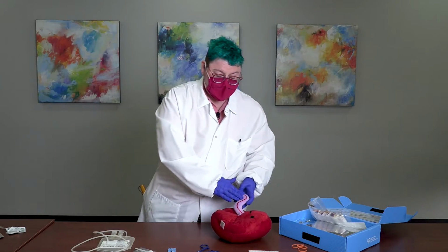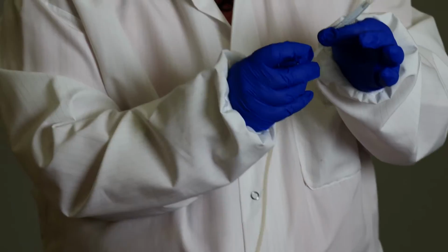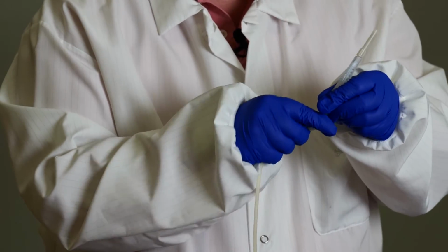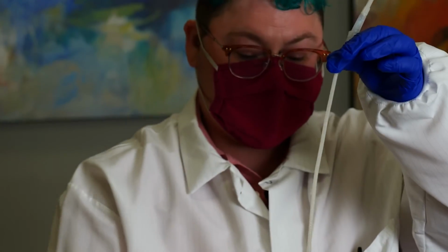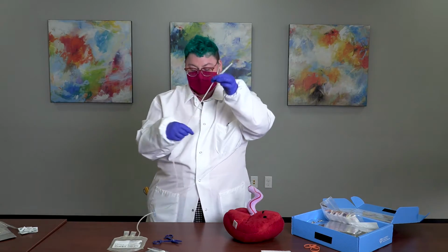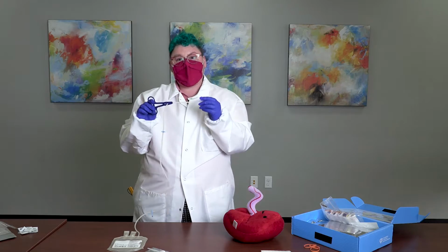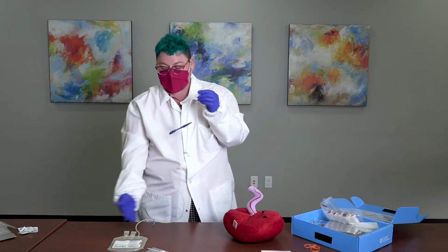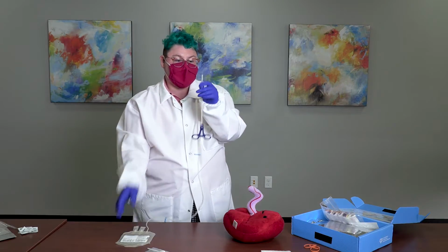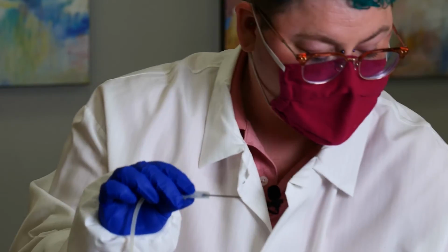Once the umbilical cord has been cleaned and dried, you'll need to get the collection bag ready. To prepare the collection bag for the collection, you'll want to attach 2 blue clamps onto the collection bag tubing line. These will be loose and easy to move, not restricting the flow. The next step is to use a hemostat and clip it behind the needle. When the hemostat is closed, it'll prevent air contamination from getting into the collection bag after the needle guard is removed. When you're ready to start the collection, you'll go ahead and remove the needle cap.